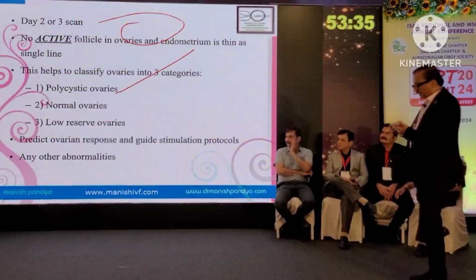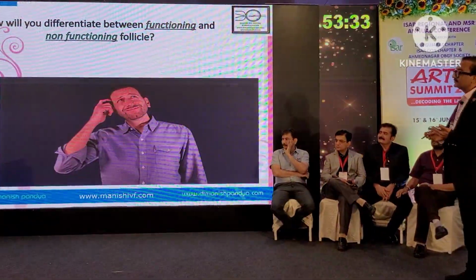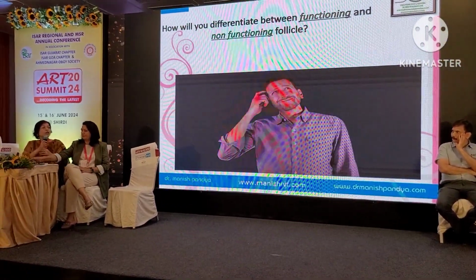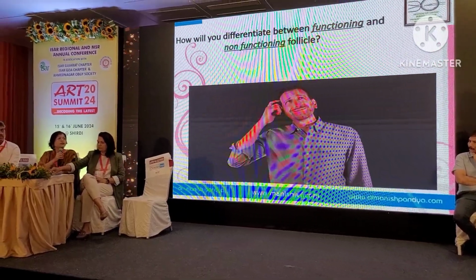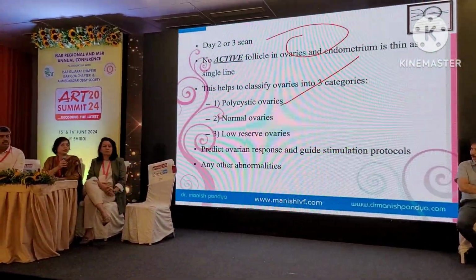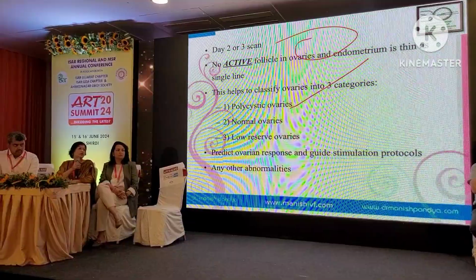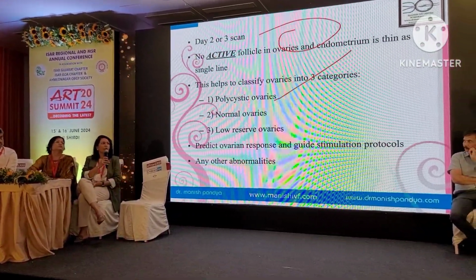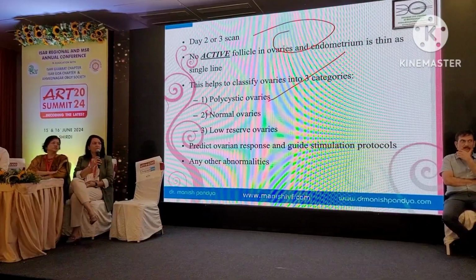Nidhi, what would you like to add? The other thing I would like to highlight is to rule out cysts, because sometimes cysts would interfere with the stimulation. So resting follicle, resting ovarian cyst. Nisha? Persistent corpus luteum also, a luteal phase deficiency which we can rule out.